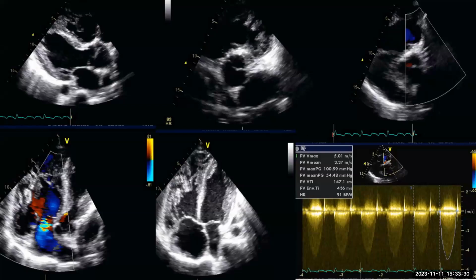A question about mitral inflow differences in tamponade and constriction. Okay. You see, mitral and tricuspid inflow variation is not specific and not sensitive. You have differences between inspiration and expiration in both mitral and tricuspid inflow when you put the pulse wave in many conditions.